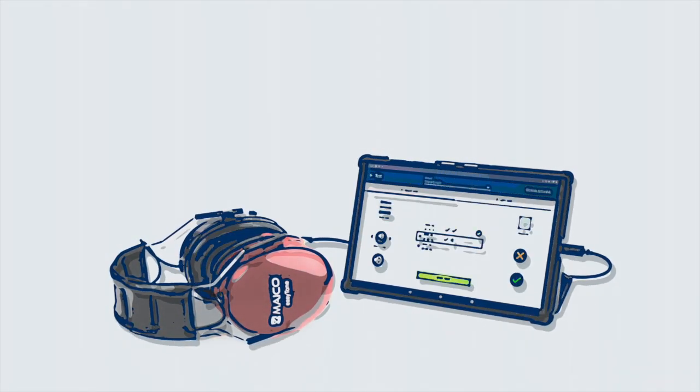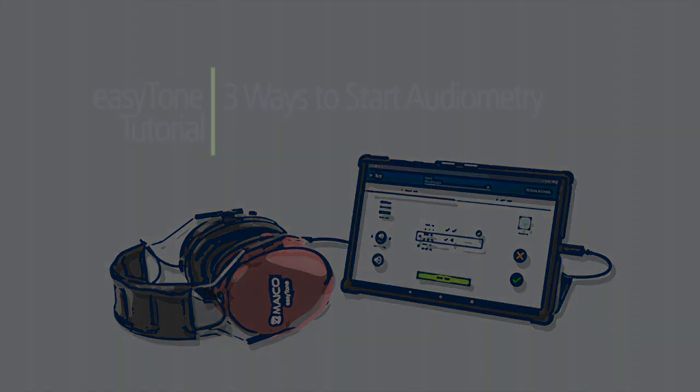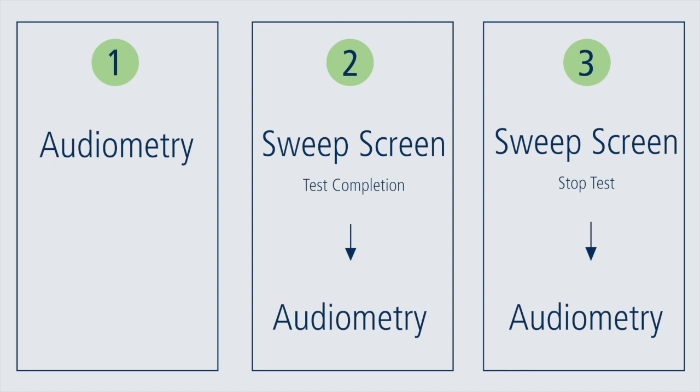This tutorial is to explain the 3 ways to utilize the audiometry protocols within your screening process. As the hearing screening process can vary by location, the easyTone offers multiple ways to perform a hearing screening.